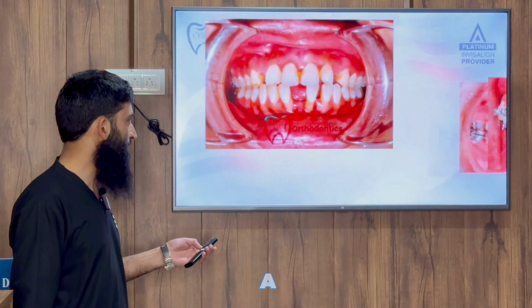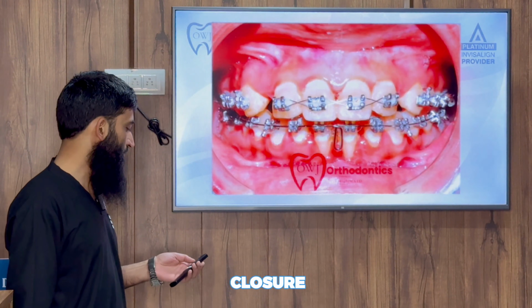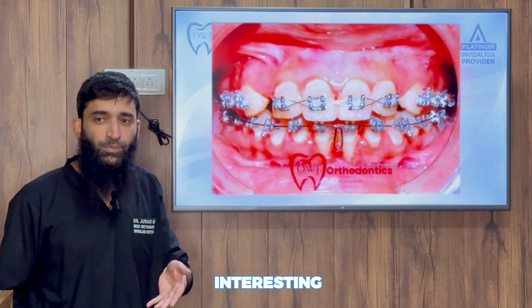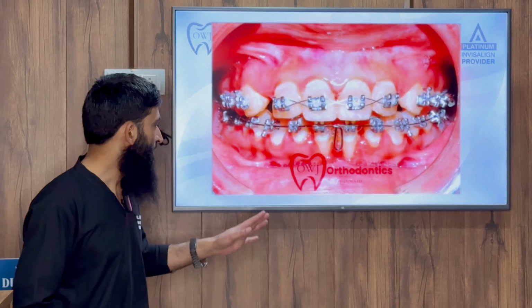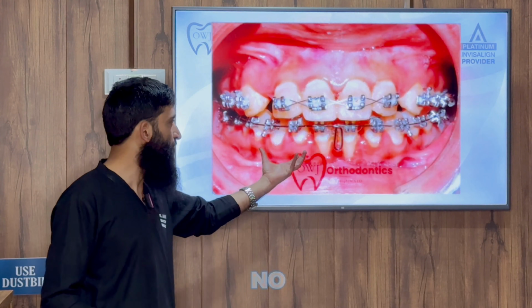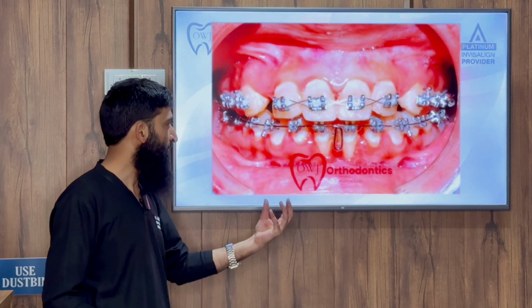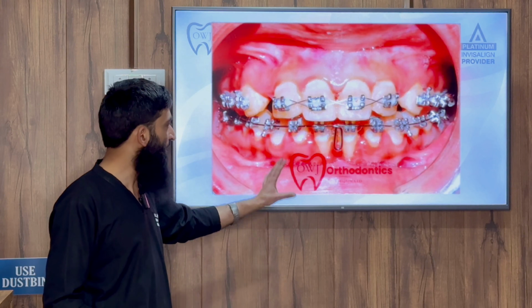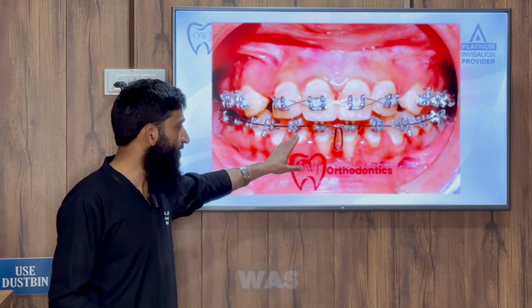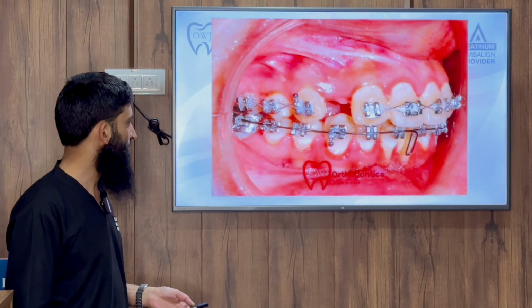So this is a space closure by a vertical loop. Space closure was done by a closing vertical loop, and the interesting part in this case is that this closure has been done in a translatory fashion. There is no tipping of the lower incisors, a bodily movement, and even maintaining the class 1 molar relation, and there was no further recession.